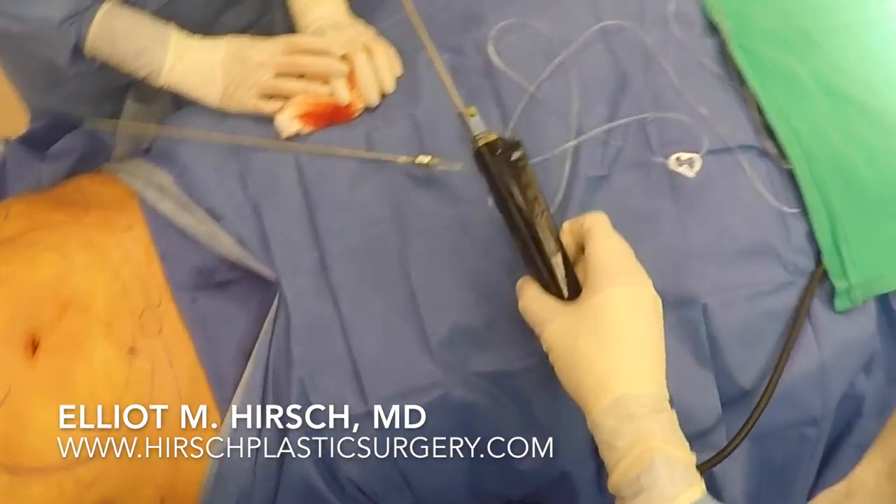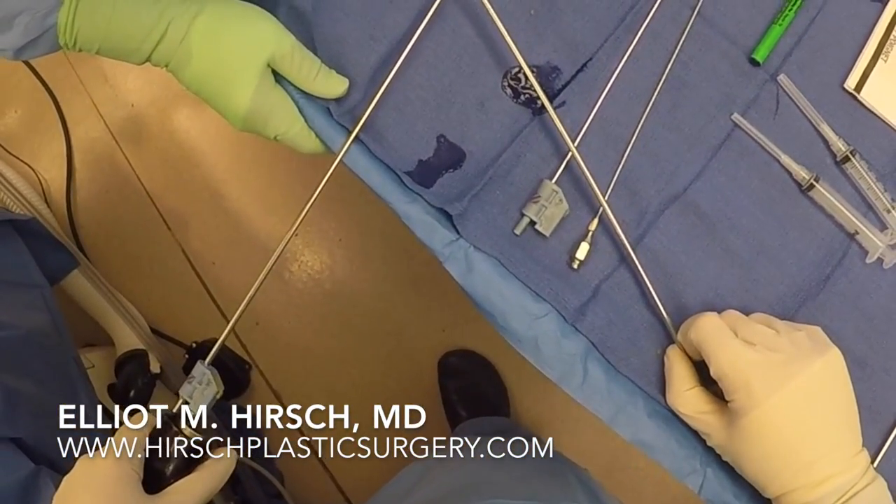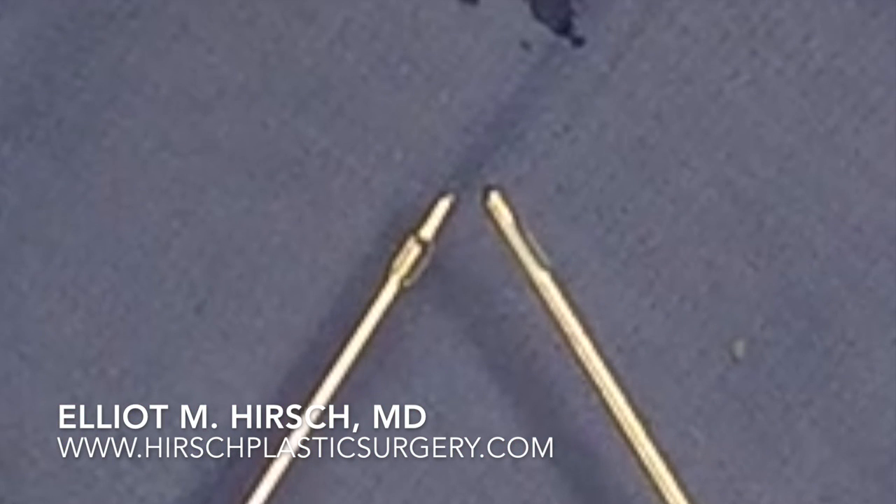Power-assisted liposuction differs from standard liposuction in that the cannula on a power-assisted device oscillates back and forth at high frequency. This makes it much easier to remove the fat.